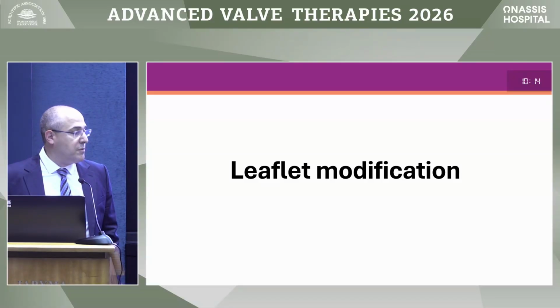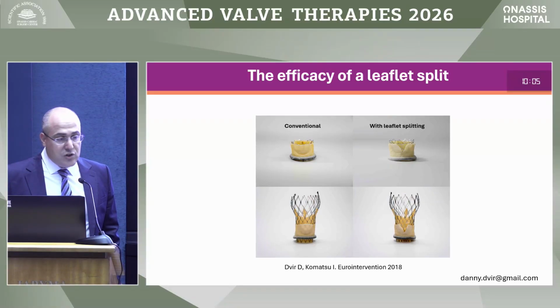Leaflet modification, I believe, would be in the next couple of years one of the most important topics within interventional cardiology, because eventually, although it started with Basilica, Lampoon, with very basic techniques, eventually we will have dedicated tools that will help us in the cath lab.